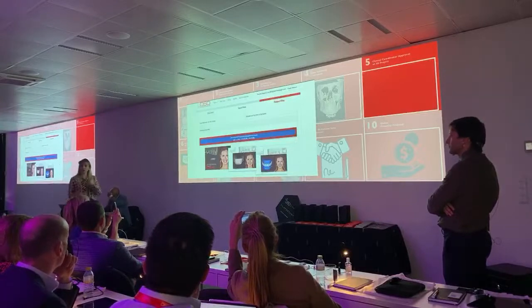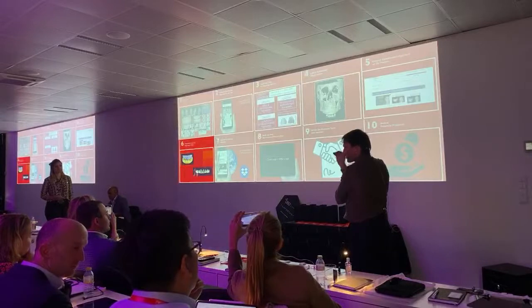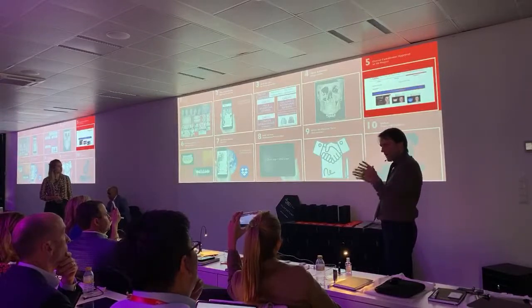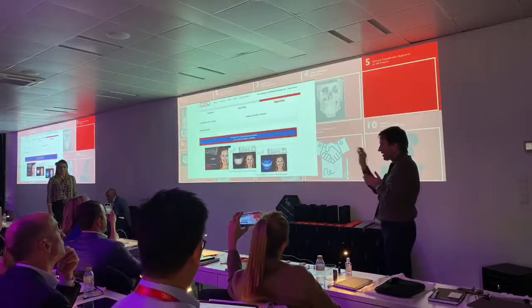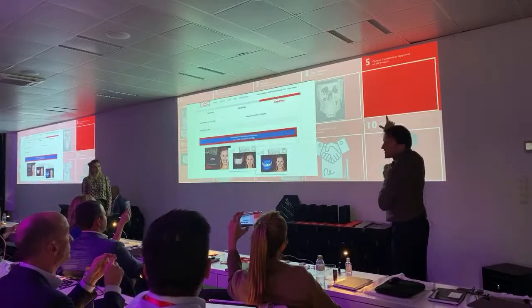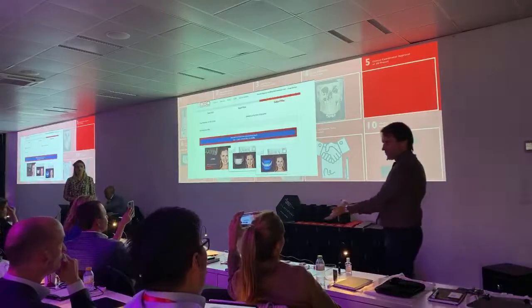And then when she has your answer back, then she will... Another thing that I suggest is that for each step, you should sit down and outline bullet points of everything that is inside this step. For example, number 5 means really like DSD for Dummies. Step number 1, go online to dsdplanningcenter.com. Find the patient's page, open page number 2, click on presentation, download presentation, share presentation on WhatsApp with the clinical coordinator. So 5 steps under the step number 5. So if you lose an employee, if somebody leaves and somebody else comes, just give them the book and say, this is what you need to do, follow the steps.